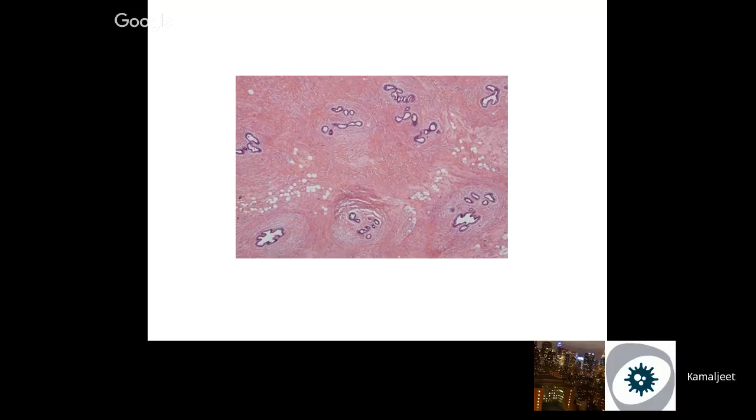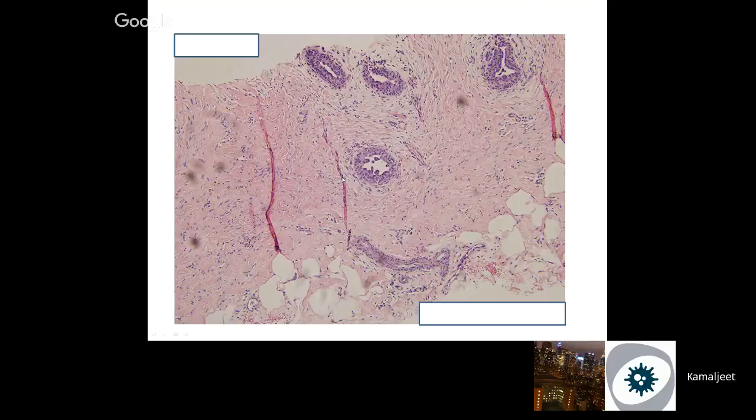Picture of the next case, gynecomastia. I think it's important. The history will be obvious, but what if they don't give you any history? What you have to tell is that it's a male breast, and you don't see lobules. What you see is small ductules, and what makes it gynecomastia or gynecomastoid change is the usual type ductal hyperplasia, in which they look like these micropapillae or snouts, which are different from the micropapillary ADH.